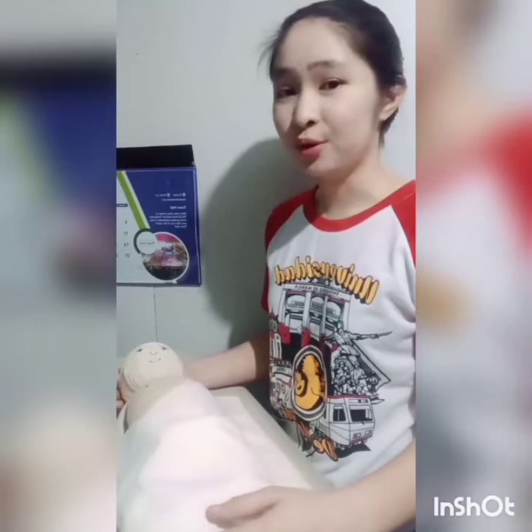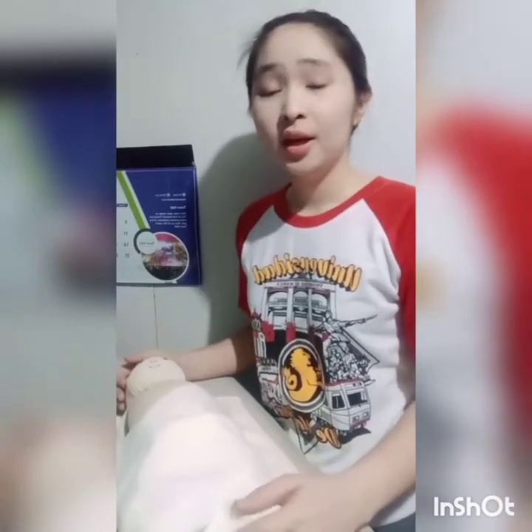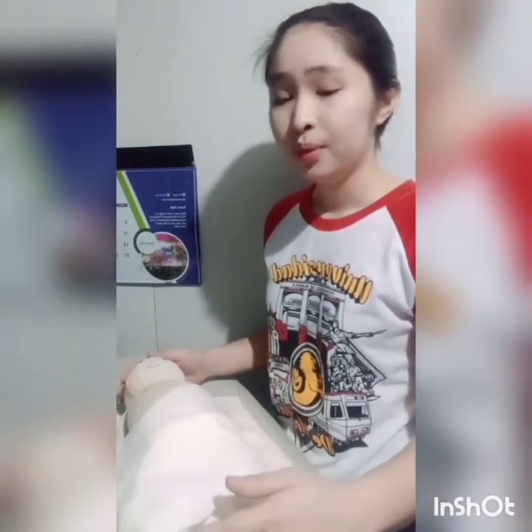So now let's perform measurement of baby Emmy's length. In hospitals, they use an infantometer to measure the baby's length, which is a long board, a plain board with a movable footboard. But without one, we can use a measuring tape.